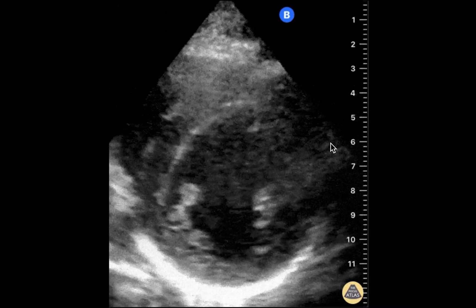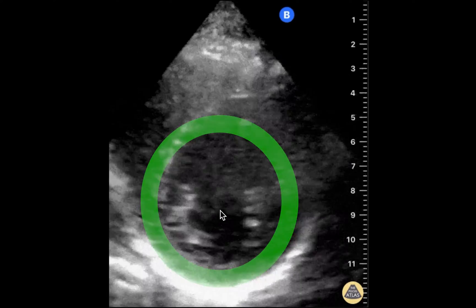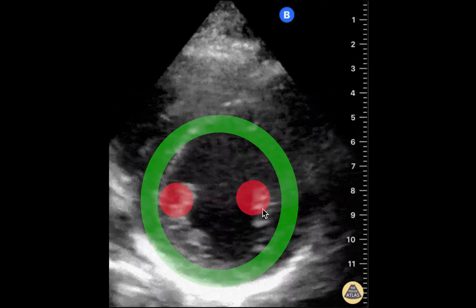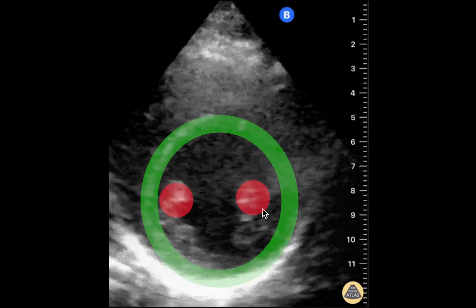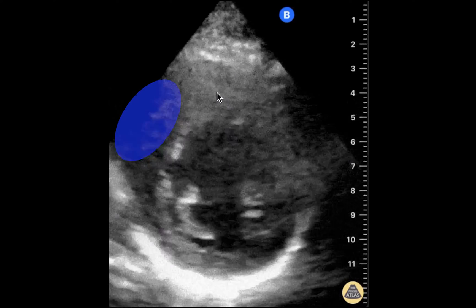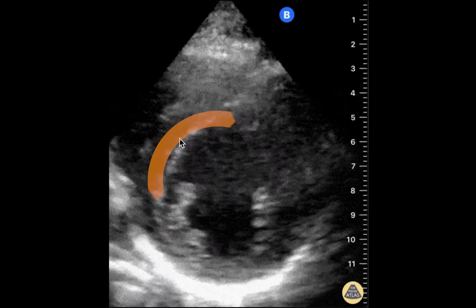In terms of the cardiac anatomy, this is the left ventricle, with the two papillary muscles on either side of the chamber, the right ventricle, and the interventricular septum.